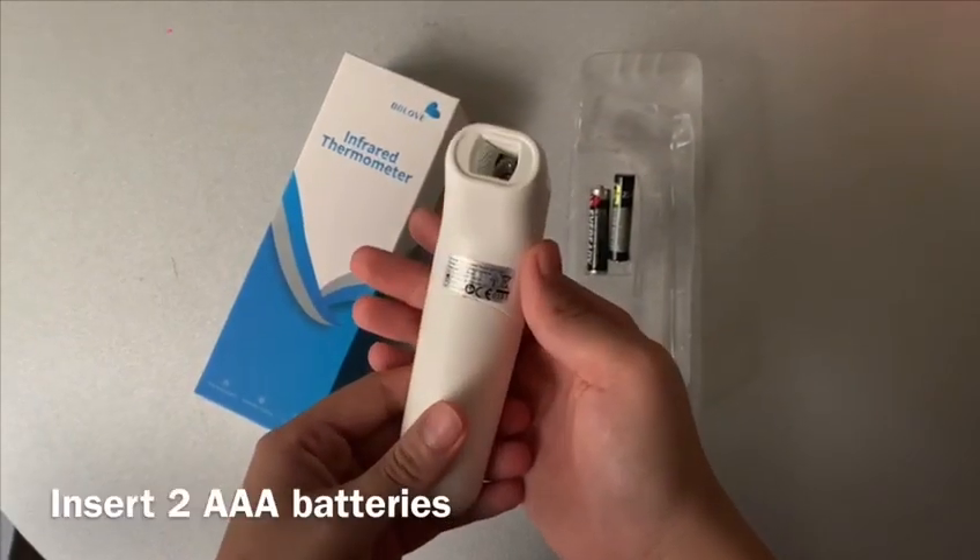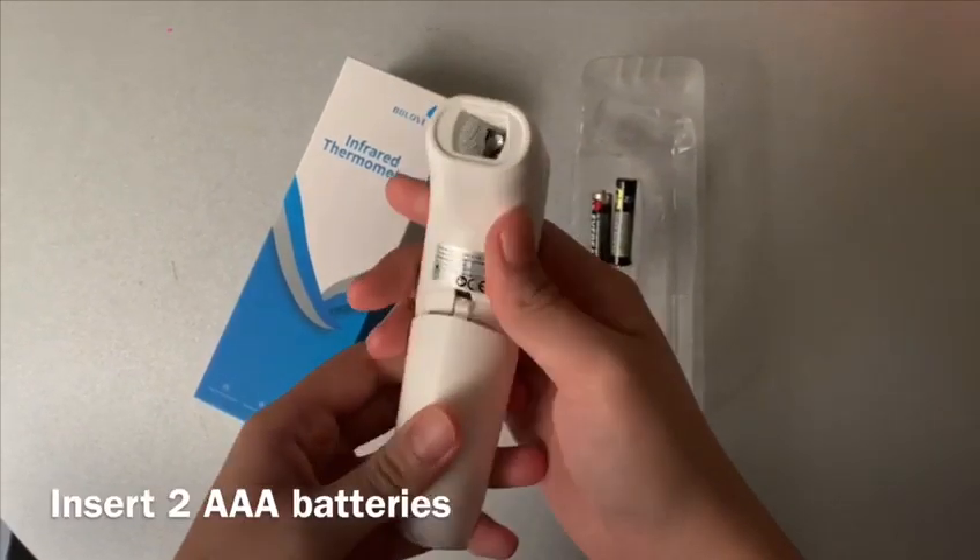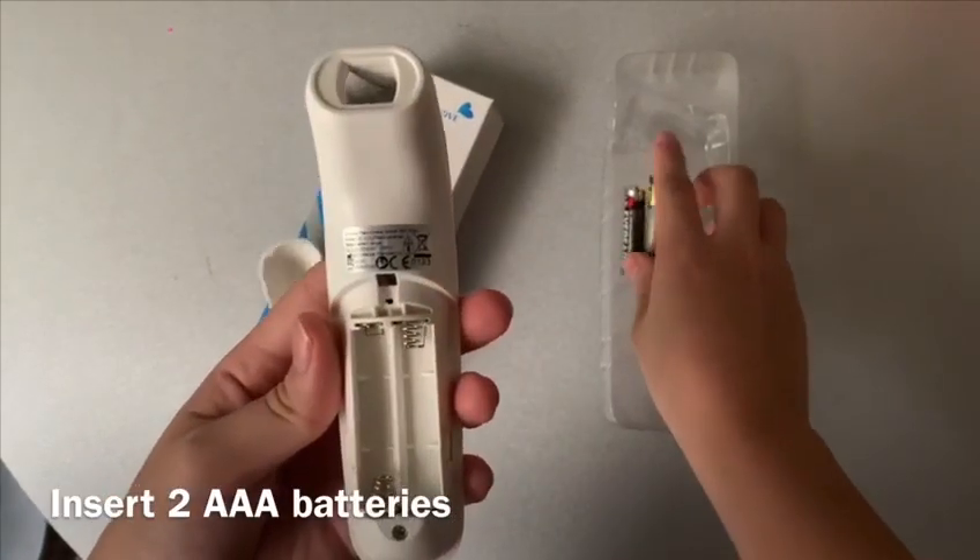Firstly, slide down and insert two AAA batteries.